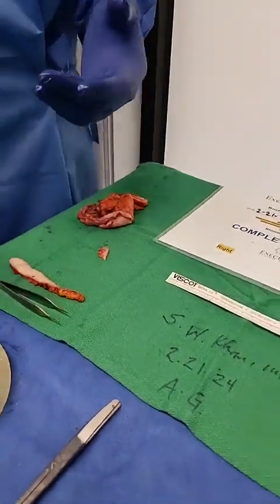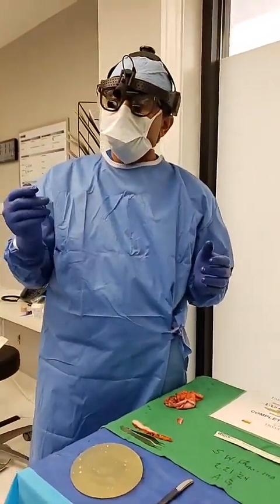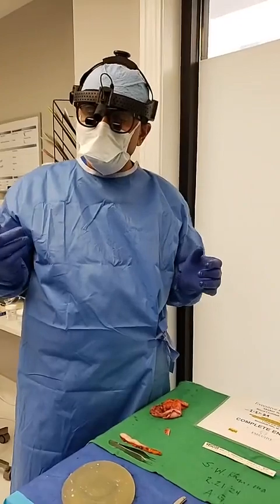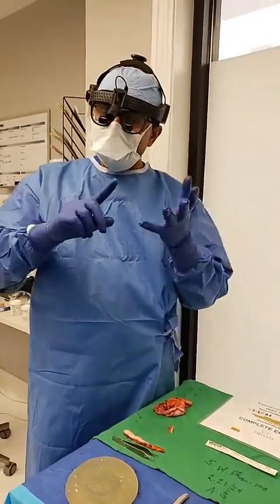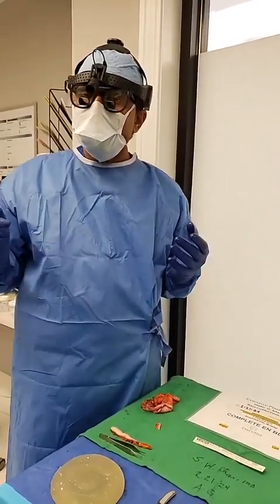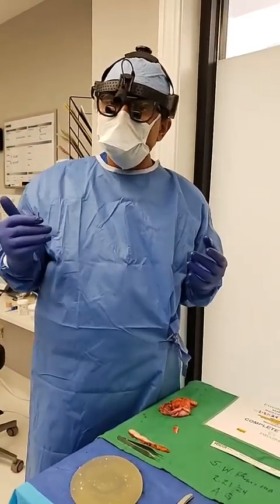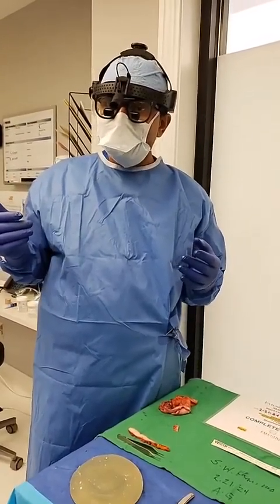So this is where you never know, by palpation, visualization, any inflamed tissue is removed, and all good, healthy, viable tissues left behind, and she'll get the best chance to bounce back. We'll certainly hear from her and how she's only going to improve, and for the rest of her life, given the pathology workup plus the microbiology workup, she'll not have any, quote, surprises later on in life. As far as potential malignancy, squamous cell, because the entire workup has been definitively done as we showed earlier. This is Dr. Khan, Executive Plastic Surgery.